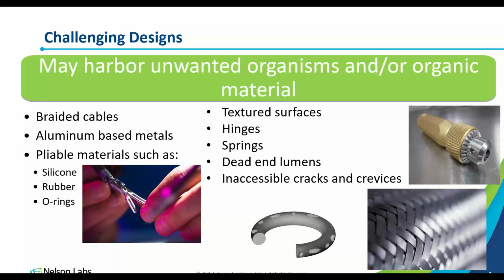Now, again, the tricky part with that is you want to make sure that the disassembly is easy and that you have clear instructions in your IFU that are clear to follow for those technicians in the sterile processing department, so that they can adequately and efficiently disassemble and reassemble that device without needing any special tools or equipment or having it take a long time, and so that they can clean it efficiently and then put it back together as needed.